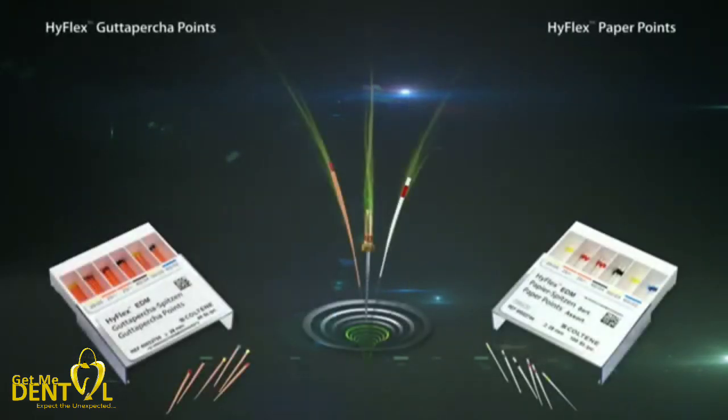For drying and filling, the successful HyFlex system also offers paper and gutta-percha points ideally matched to the proven nickel titanium files. Standardized working lengths and conicities thus ensure the success of endodontic treatment and at the same time ensure smooth procedures in dental practice.